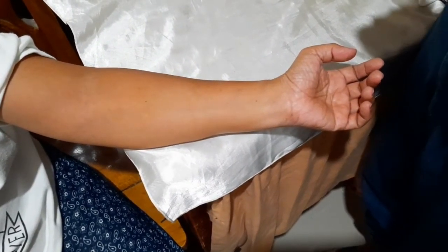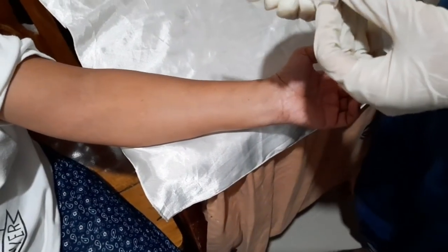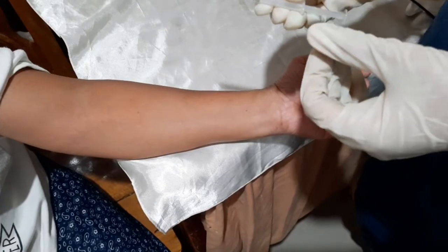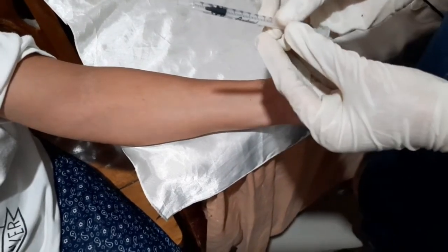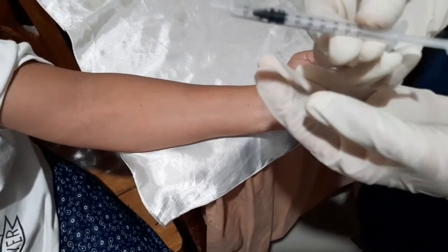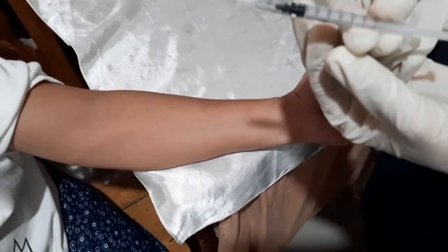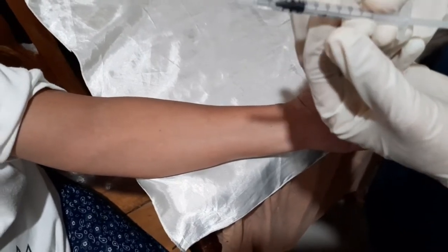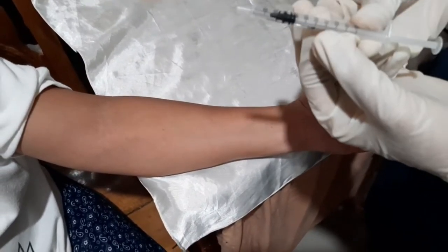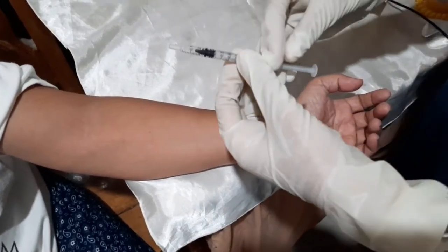Then we're gonna take our syringe with our bevel up and we're ready to inject. So in my procedures, I'm not gonna use a needle, as you can see, but I'm gonna show you how to properly position it to its right angle. So now we're ready to inject it.